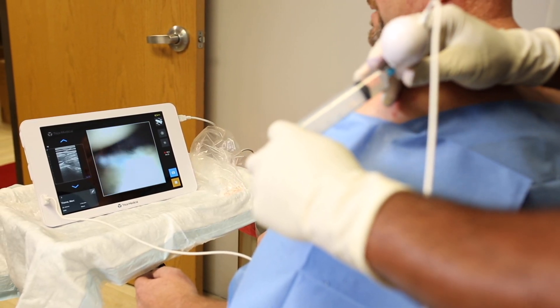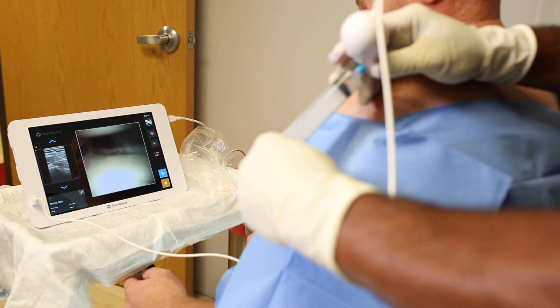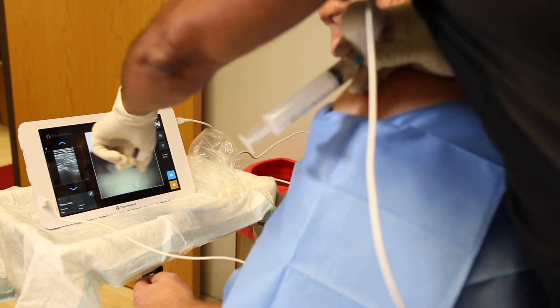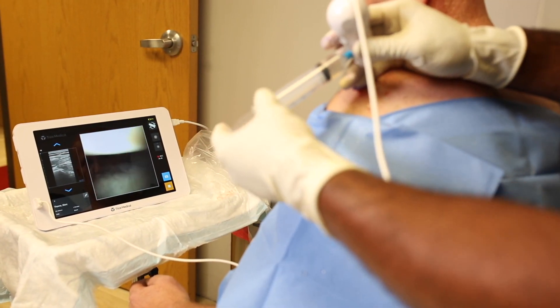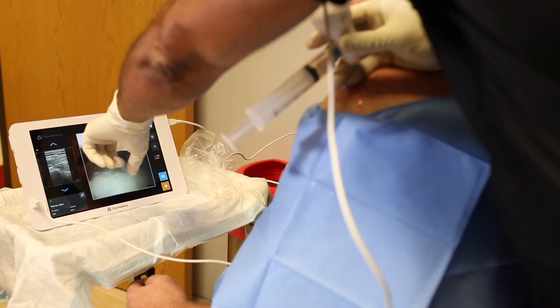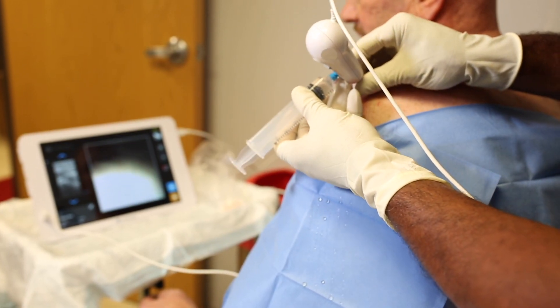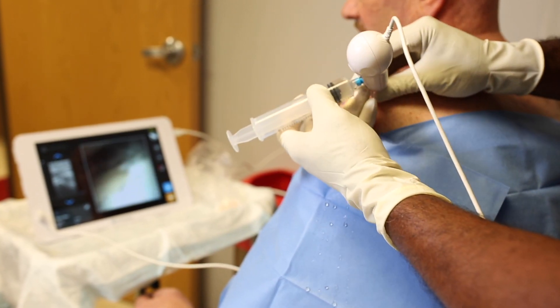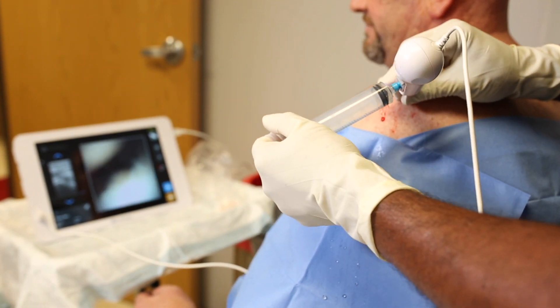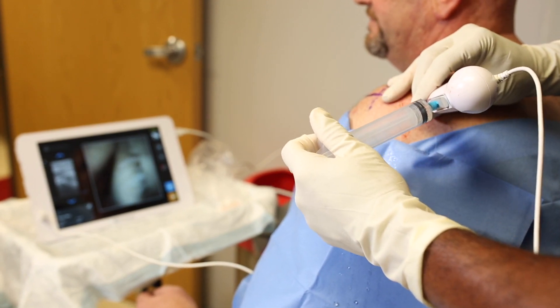One of the nice things about setting up the tablet in this way is it allows me to interact with the patient and keep them involved in the procedure. I can talk about and point to things on the screen — showing areas of degenerative cartilage changes, old sutures, or intra-articular pathology in general. We have monitors in all of our exam rooms and can connect the display to a larger monitor via HD, which I like to do when family members are present and want to watch.